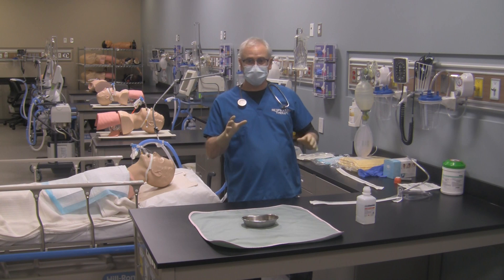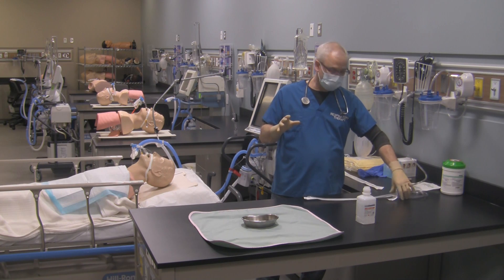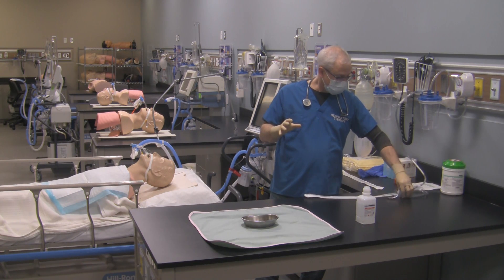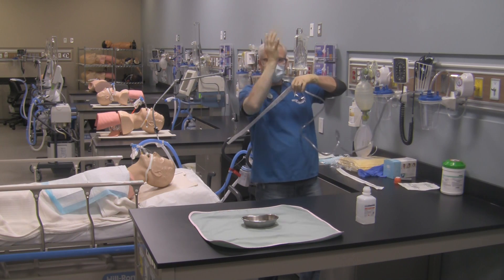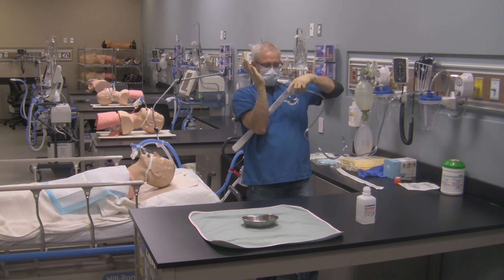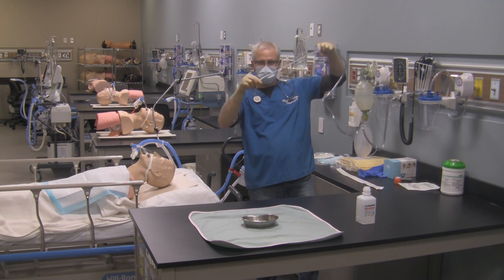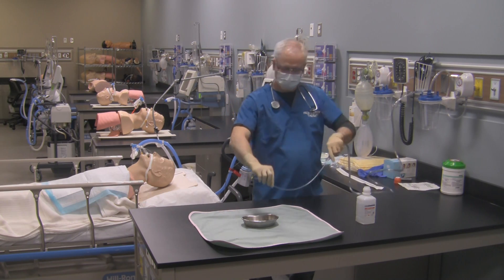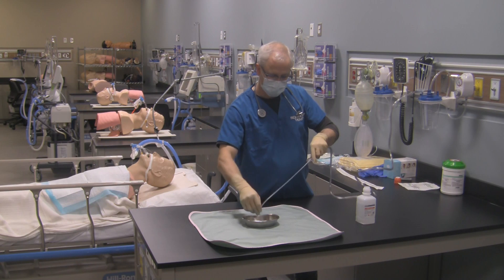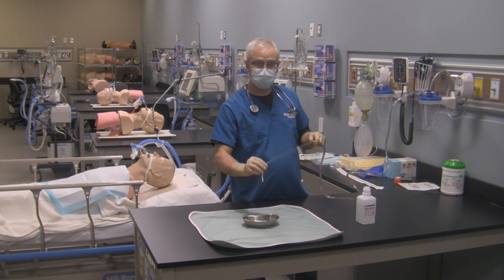Now what I need to do is get this suction catheter out of its protective sheet. To do that, grab the suction catheter and the tubing together by the thumb control part. Take the suction catheter packaging, put it underneath your arm, pull it out like so, and grab the catheter with your sterile hand because this is sterile — the other side is clean. Now simply lubricate with normal saline and test out your suction to make sure it's working — and it is.